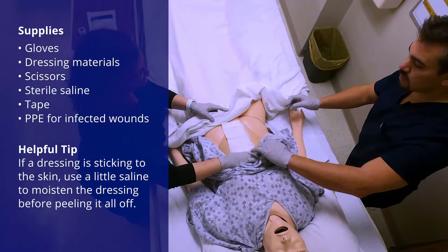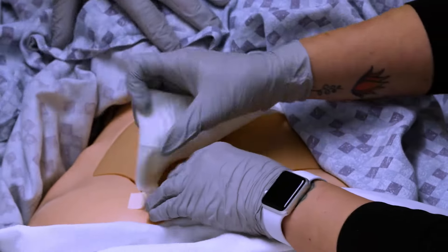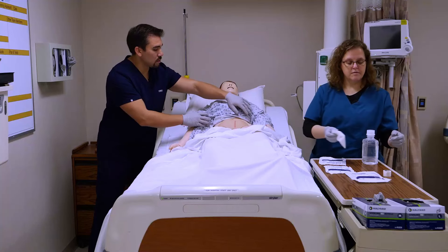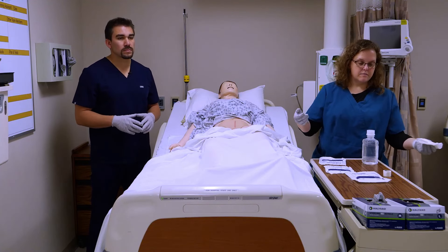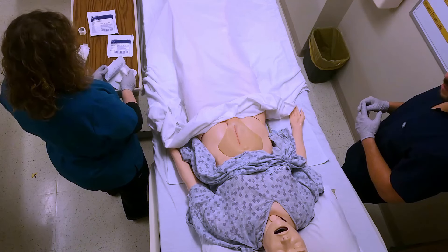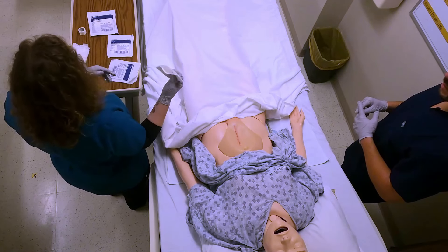So we're going to uncover and remove the old dressing. Normally you can put on whatever came off of it — that's what you're going to put back. Then you're going to throw this away, and I'm going to clean her incision.